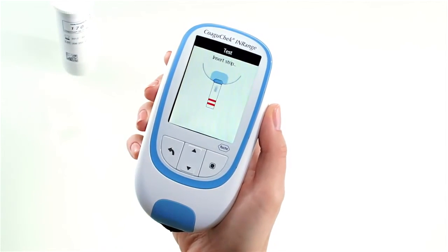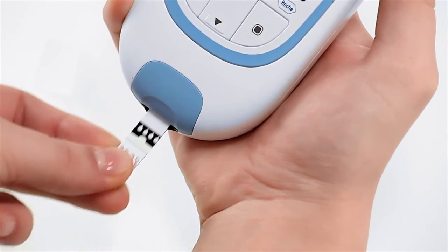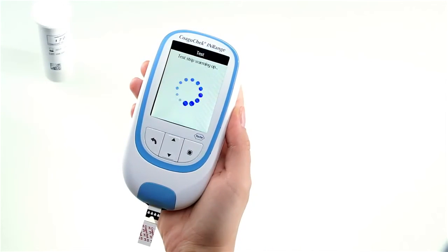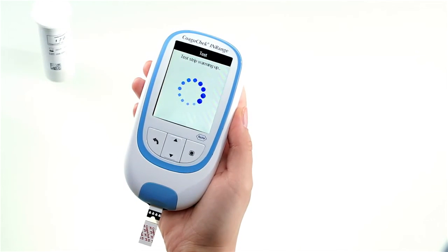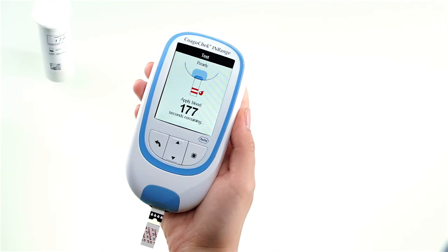Hold the test strip so that the arrows are facing upwards. Slide the test strip into the test strip guide as far as it will go. Once the test strip and blood drop symbols appear on the screen, the meter is ready to test your blood sample. You now have 180 seconds to apply your blood to the test strip.